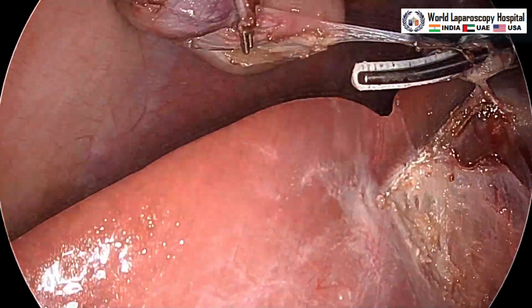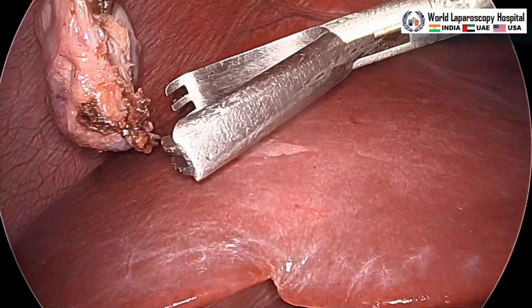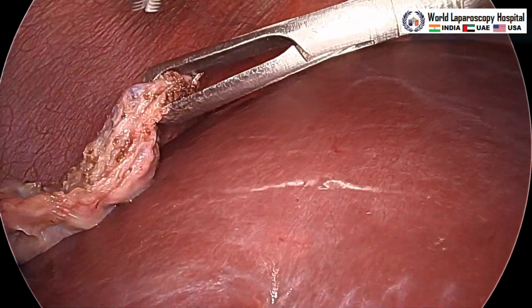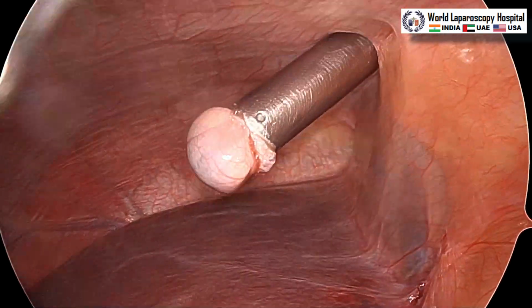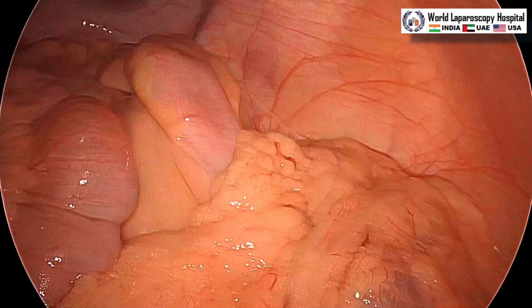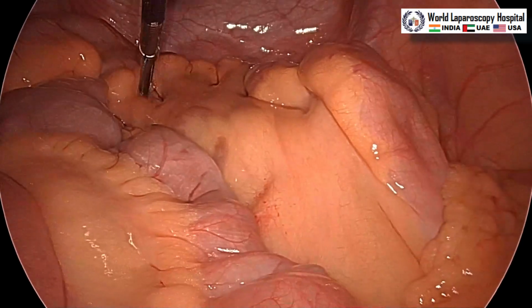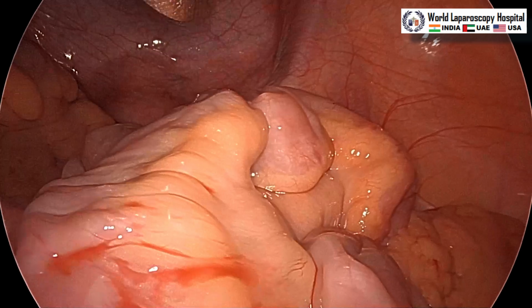So, this is over. After that, we can bring a claw forceps from the epigastric port, and then the gallbladder will be pulled out. Here we are not using an endo bag to remove the gallbladder because it was pulled into the cannula and then taken out. After that, we are putting the telescope in the epigastric port and one grasper in the umbilical port, and all the mesentery and small bowel will be moved up.